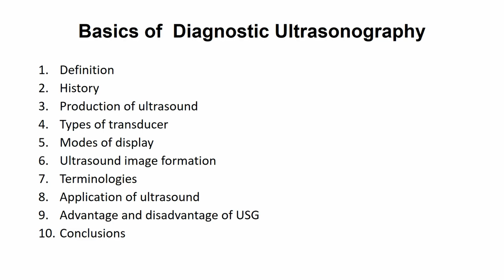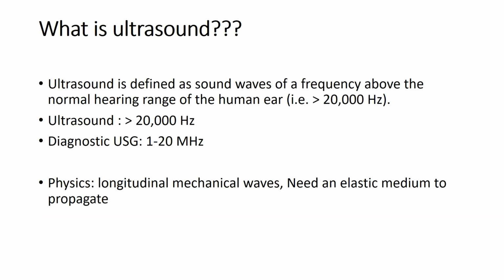First the definition, then history, production of the ultrasound, type of the transducer, mode of the display, ultrasonic image formation, various terminology, application of the ultrasound, advantage and the disadvantage of the ultrasonography, and finally conclusion.